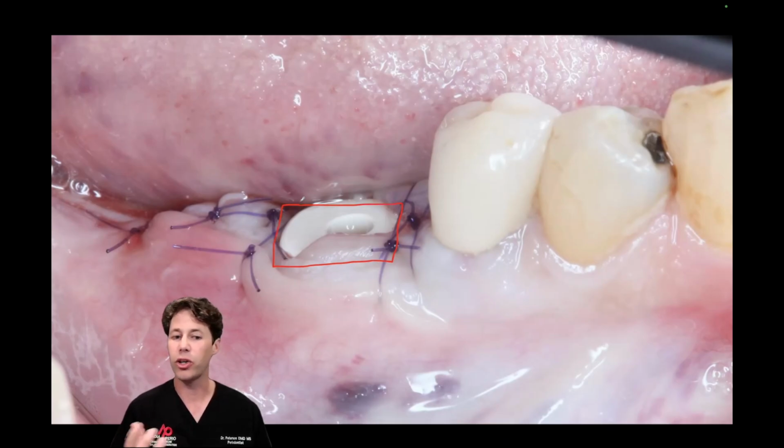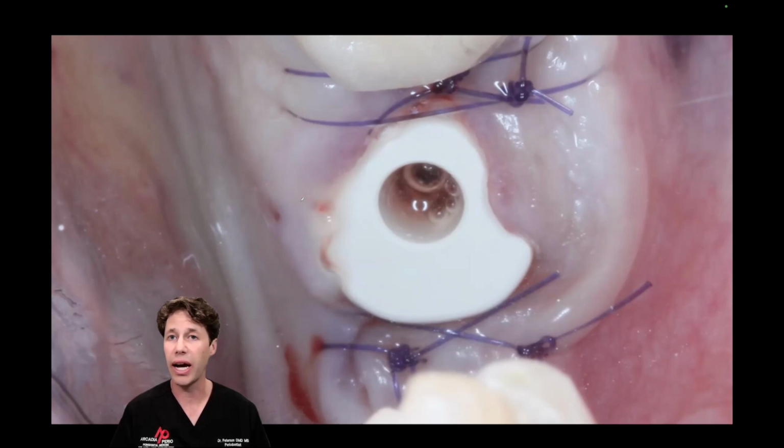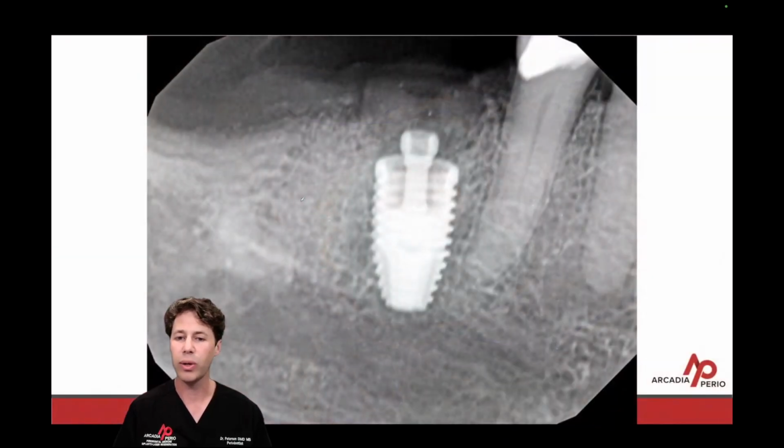And you can see here we got good primary closure, but let's take a look at the occlusal. So in a good position, you can or cannot cover that access if you want. What I like to do is sometimes I'll put in a medium body to cover that plug with no Teflon tape, and it pulls out real easily when it comes to doing your torque test or ISQs at the 4 to 5 month mark to check your integration. But everything's closed up and healing well.